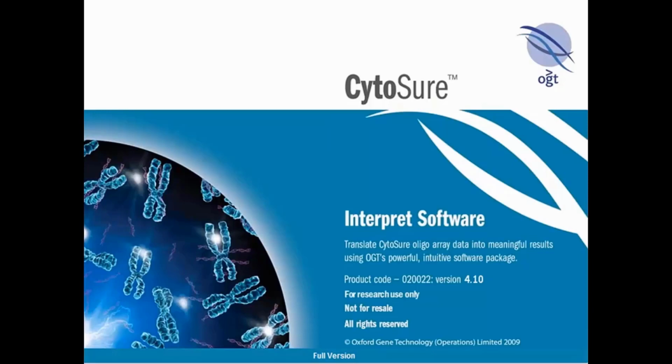This video will show how high throughput sample processing can be streamlined by combining two CytoSure Interpret software features, which make it possible to automatically associate feature extracted data with samples that are already in the software database. The first step is to import the sample data.